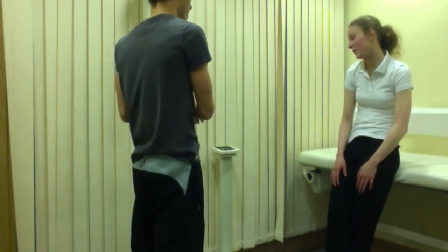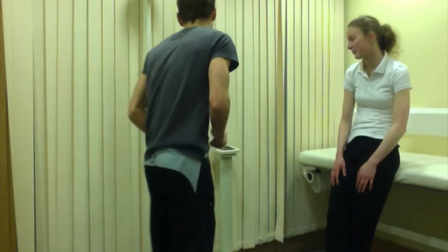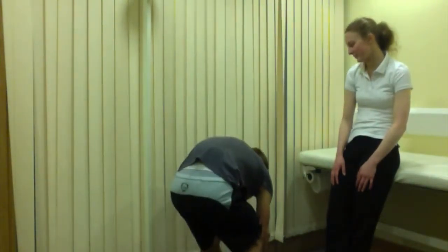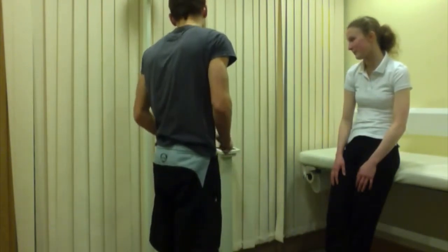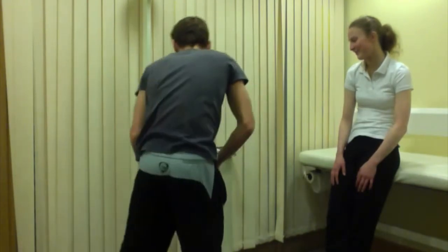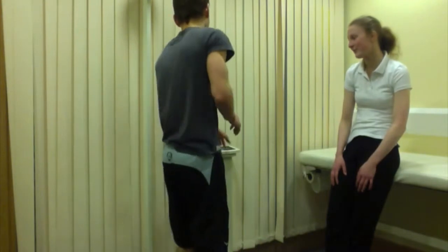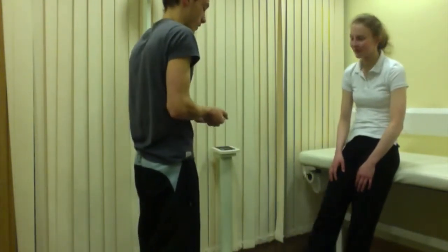The next test is your weight. Before we start, I'm going to push start and place a 5kg weight onto the scales to verify it's calibrated correctly. It has come up as 5kg, which means it's accurate and won't affect your reading. If you wouldn't mind taking off your shoes, please.